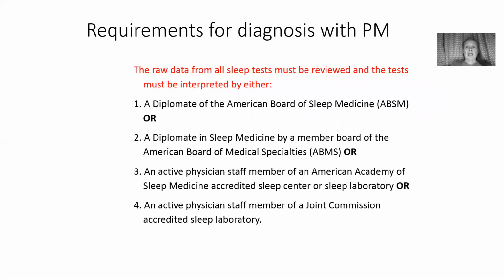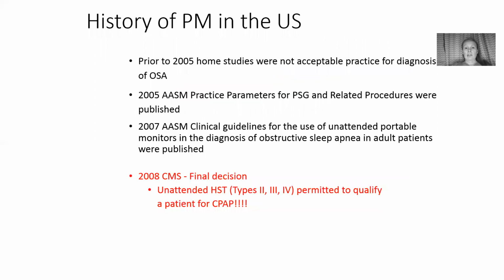The requirements for diagnosing a patient with portable monitoring: this isn't different than a normal sleep study, because all sleep tests must be reviewed and the test must be interpreted by someone who is a physician. Here it just outlines exactly what types of physicians can do it. Basically, they either need to be a member of the American Board of Sleep Medicine, or a member of the American Academy of Sleep Medicine, or a staff member of any Joint Commission accredited sleep laboratory. So again, your sleep physician needs to review all the raw data.